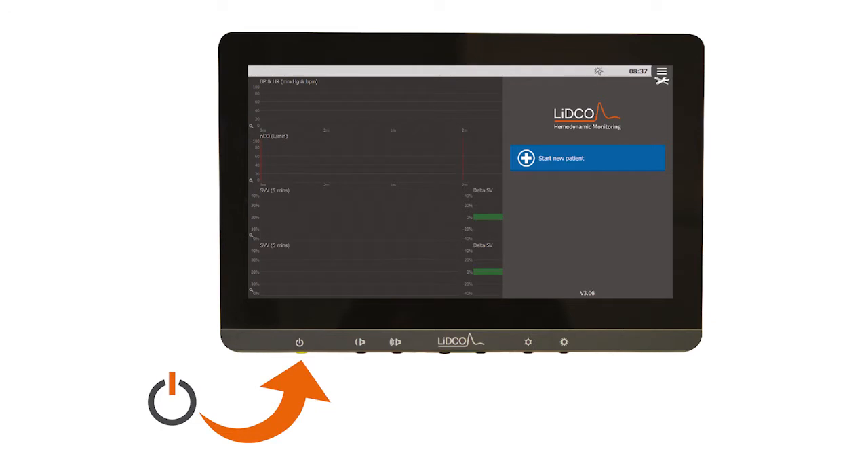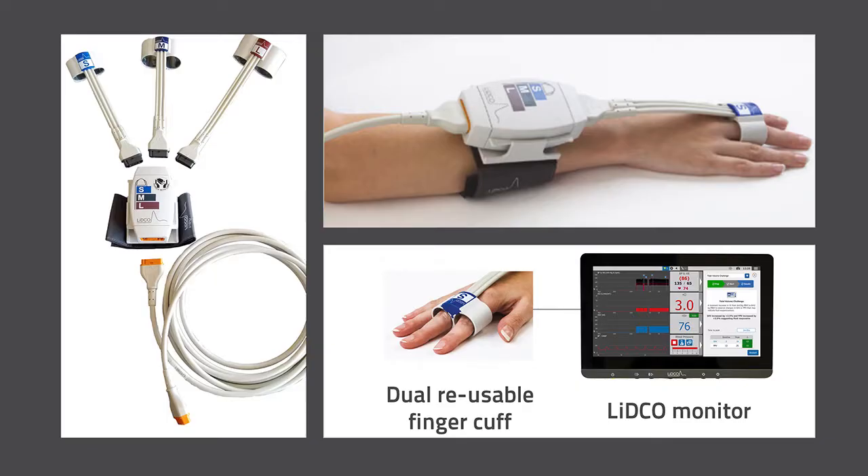First, power on the LIDCO monitor by pressing the button underneath. Then assemble the necessary accessories, which include a dual finger cuff, a cuff controller, and a cable. Place the small, medium, or large finger cuffs on two fingers as shown. Connect to the cuff controller on the forearm and connect the controller cable to the LIDCO. All the connections are color-coded to make it easy.